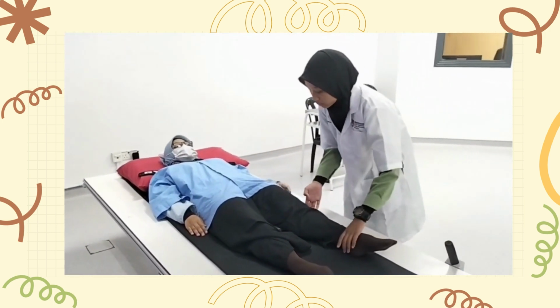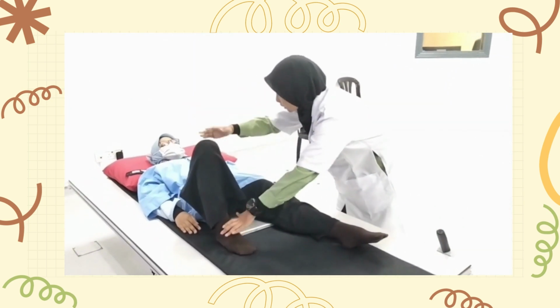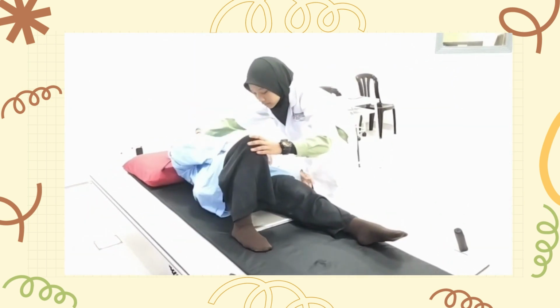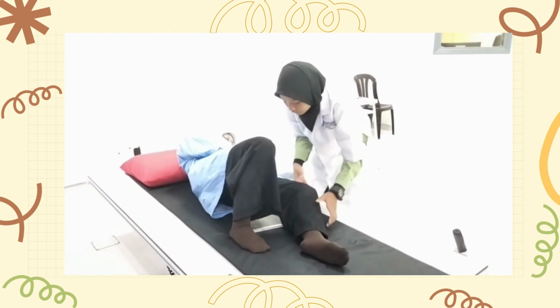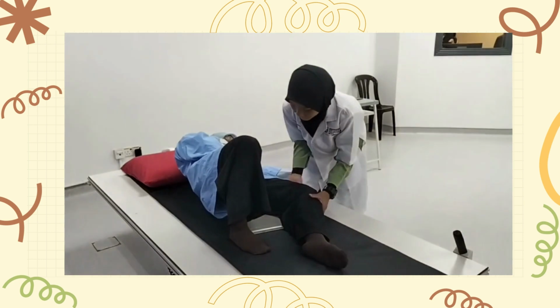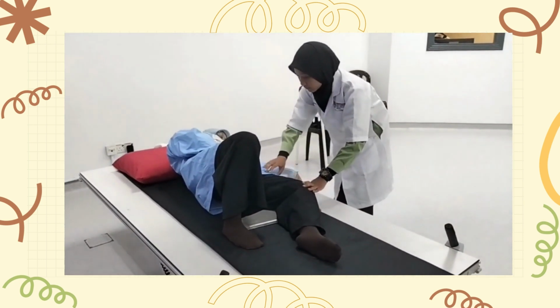Okay, can you move this leg? Okay, and your body like this. I'm sorry, I touched a little bit, okay?